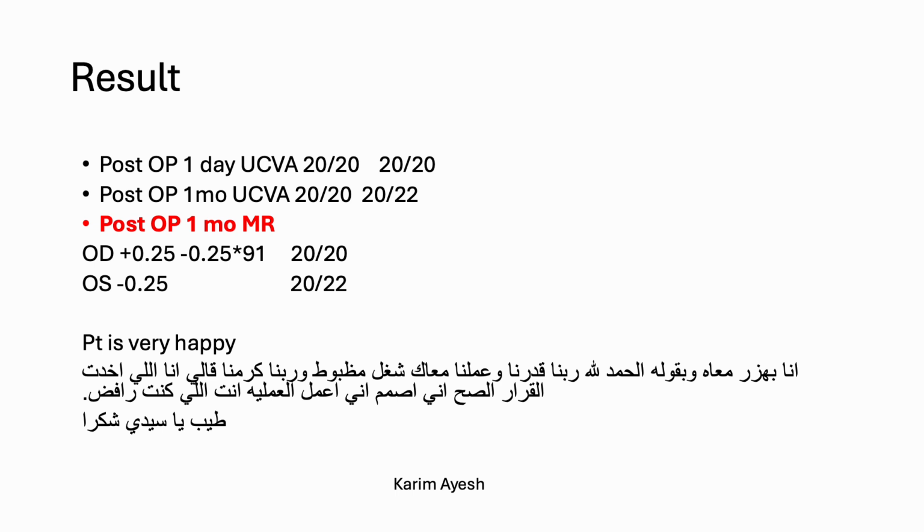So while doing surgical planning in cases of corneal scars, we always have to know the location of the scar, and we have to know the thickness and density of the scar, because maybe the femto laser will not transmit through this scar and cause serious problems like buttonholes. And you have to calculate the ablation and know the meridian of ablation.